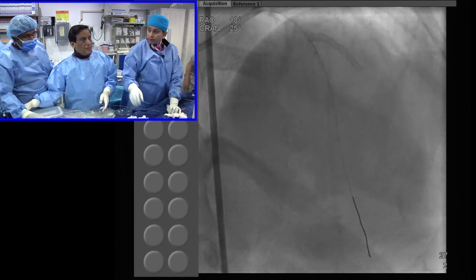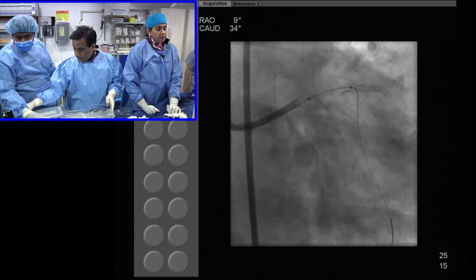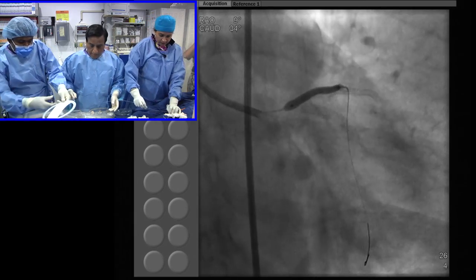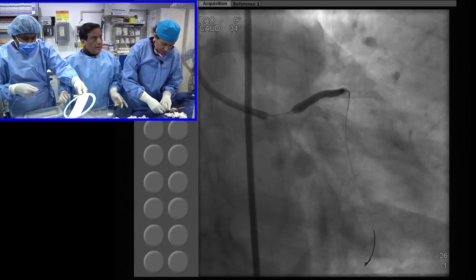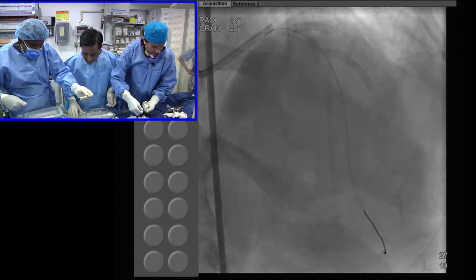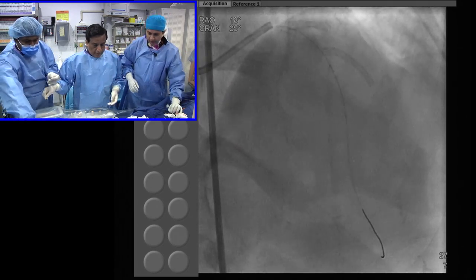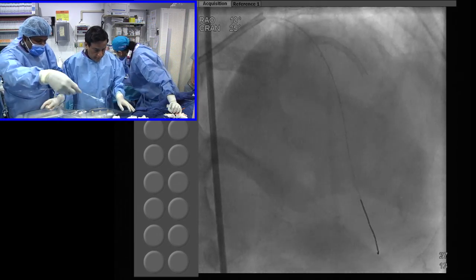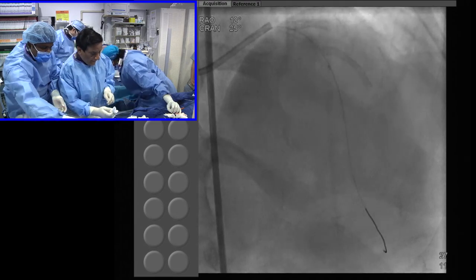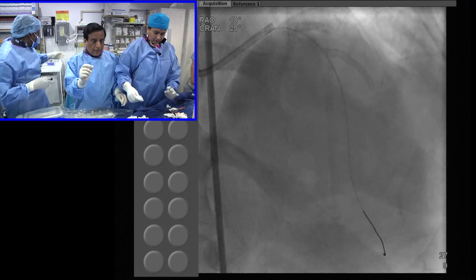So the question always comes up, do you need to dilate? The key is that when you are inflating, you will not see the marker. Once you have deflated, the stent is about 0.3 millimeter outside the marker. So that's the key. The marker is between 1 to 3 millimeter based on the stent size, so any time you are dilating at the marker, you're fully covered.